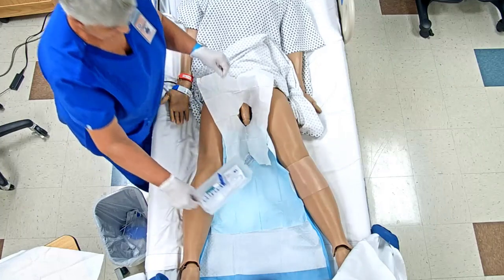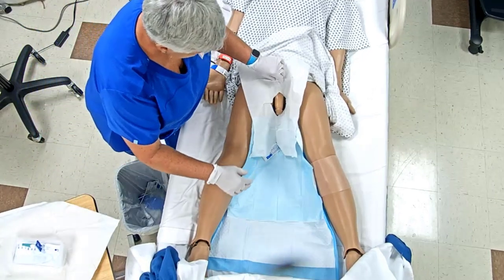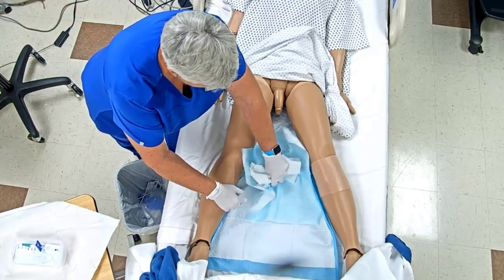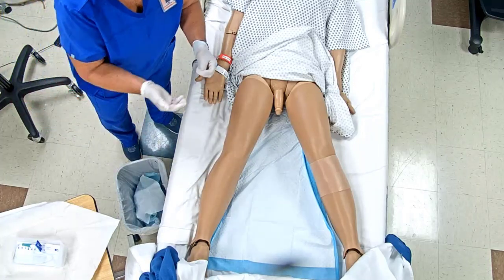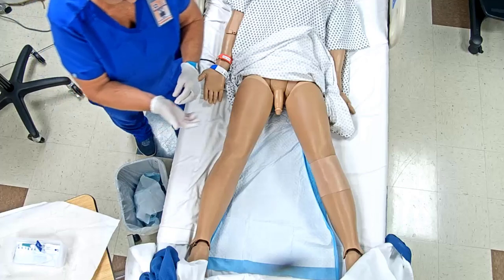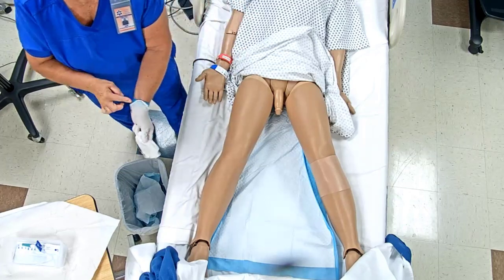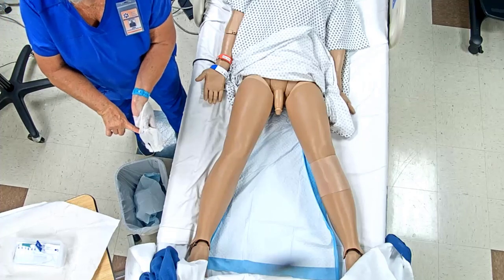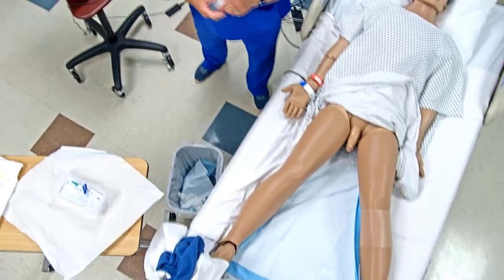And I'm going to go ahead and take this, and I'm going to place it over there. And I'm going to get all of this part of my supplies, put that in the trash. Now I've got stuff all over my gloves, so I'm going to go ahead and do glove to glove, skin to skin. And I'm going to do a medical hand wash.